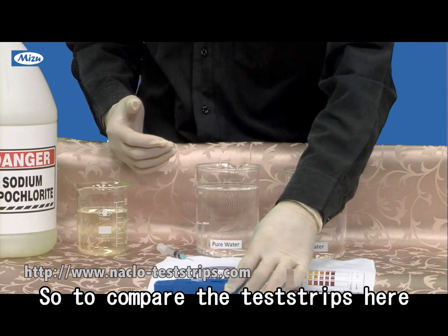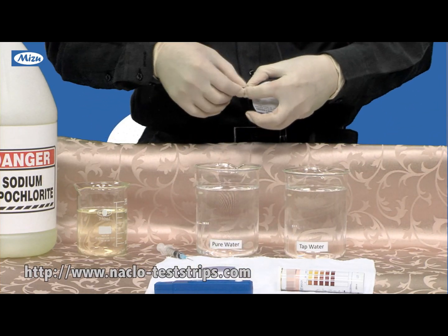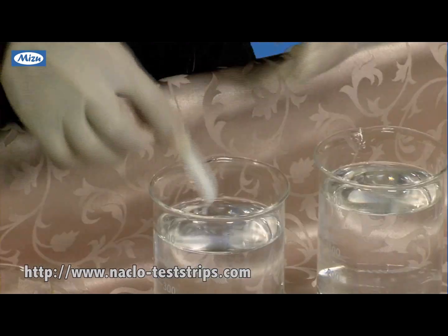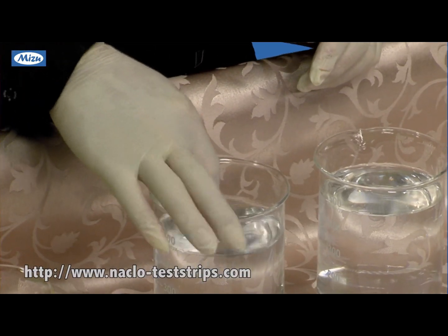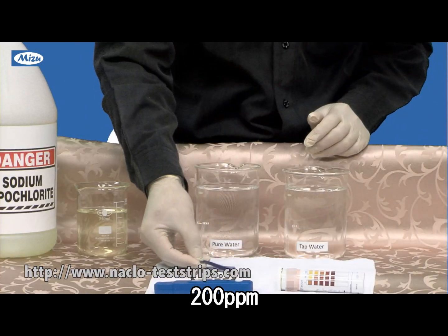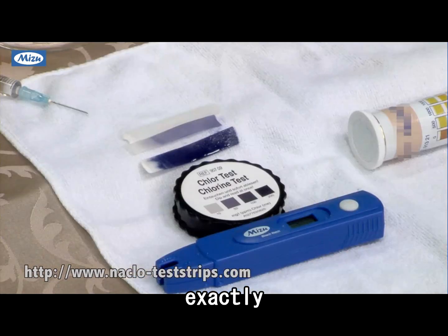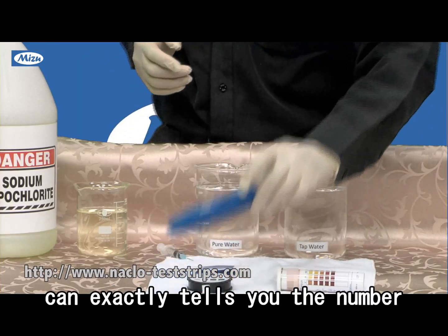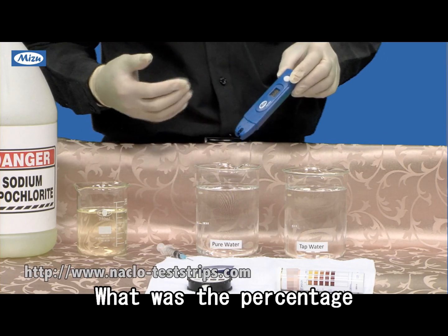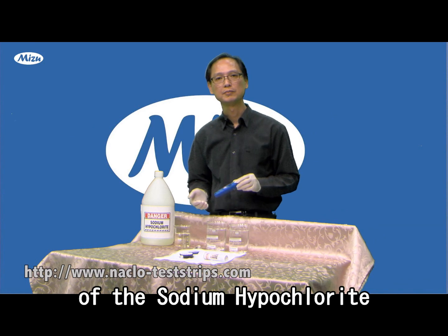So I compare with the test strips here — that is the color for 200. Exactly. So you can see this pen can exactly tell you the number, what is the concentration of the sodium hypochlorite.